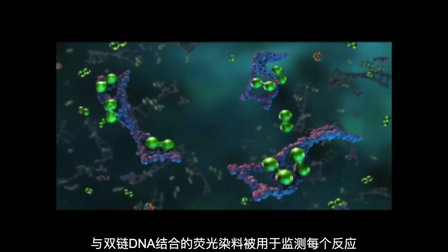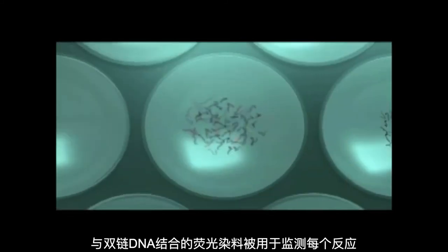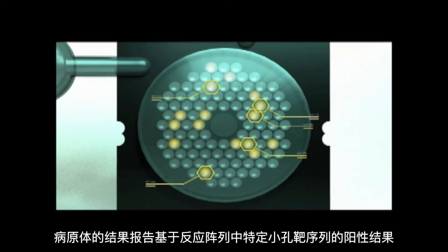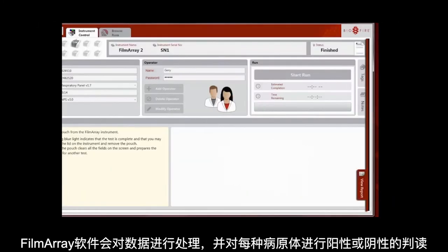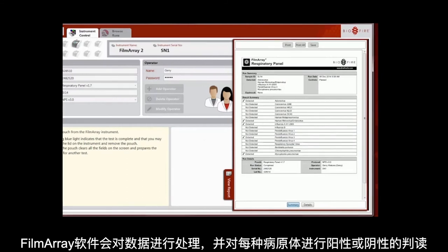A fluorescent double-stranded DNA binding dye is used to monitor each reaction. The second stage primers in each well are designed to detect one specific target. Organisms are identified based on which wells in the array are positive. The FilmArray performs a melt to confirm the presence or absence of specific temperature signatures of the second stage PCR products. The FilmArray software processes the data and makes a positive or negative call for each organism.